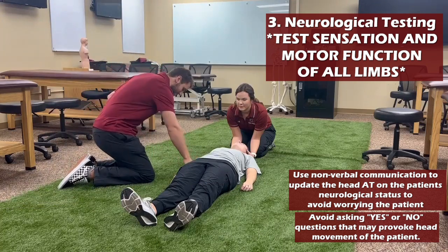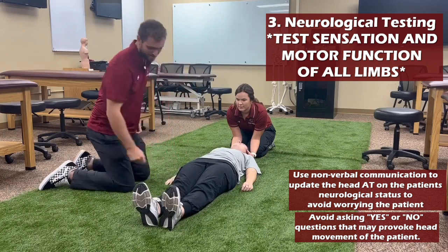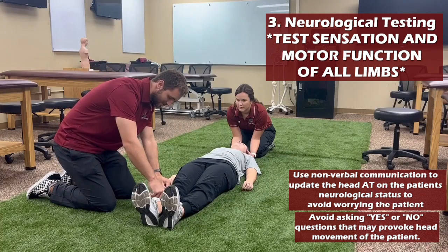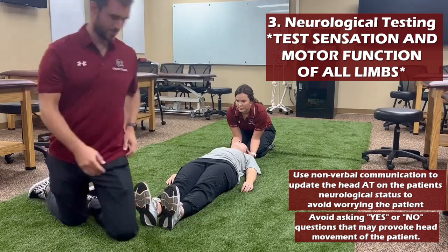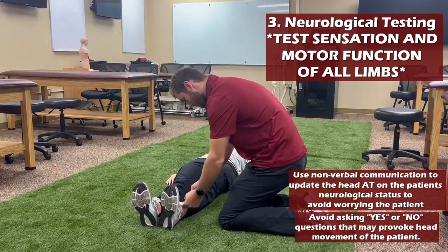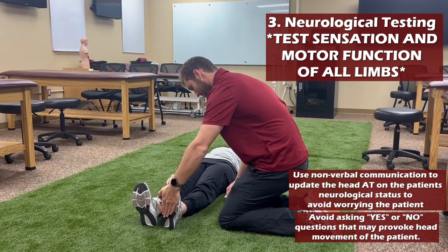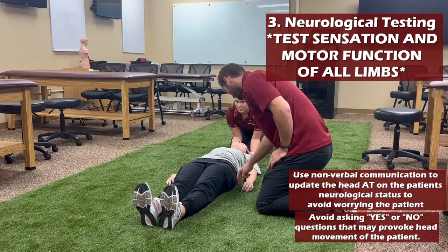Can you tell me which arm I'm touching? Right arm. Can you squeeze my fingers? Can you tell me which leg I'm touching? Right leg. Can you push down on my hand? Can you tell which leg I'm touching? Left leg. Can you push down into my hand? Can you tell me which arm I'm touching? Left arm. Can you squeeze my hand?